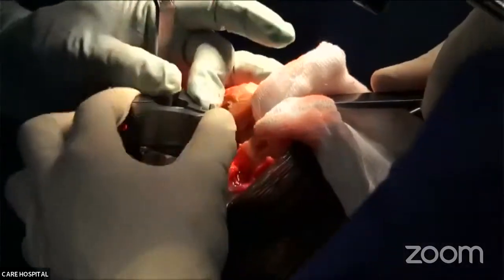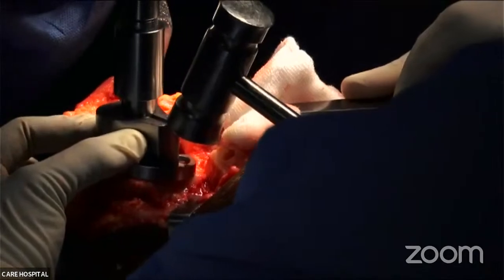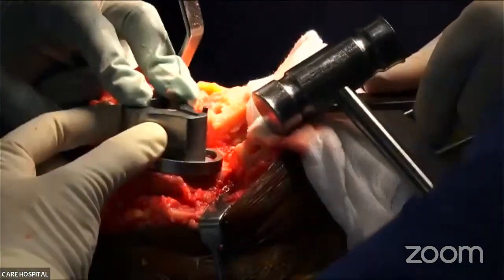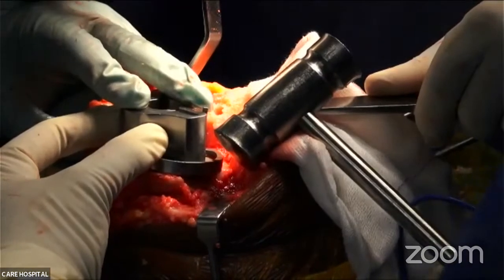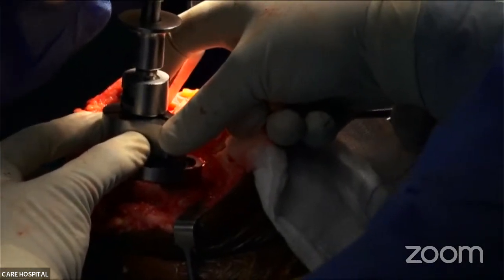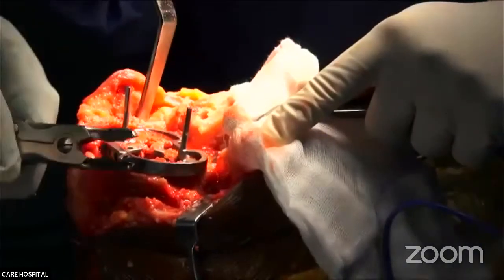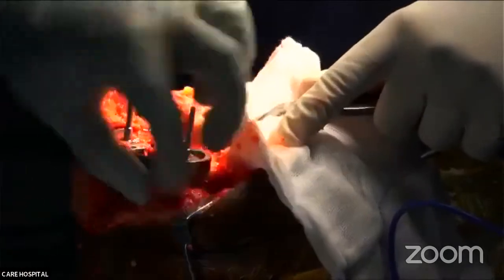Drill. So. Broach. Nibbler. Okay. Pin remove.